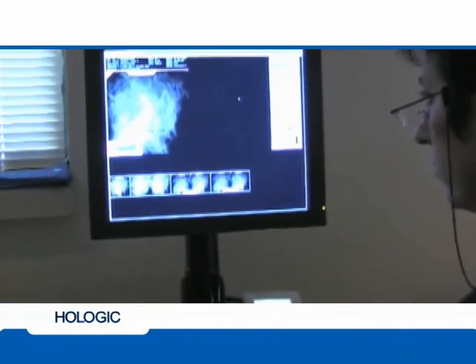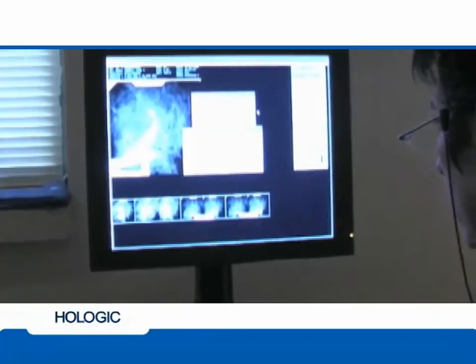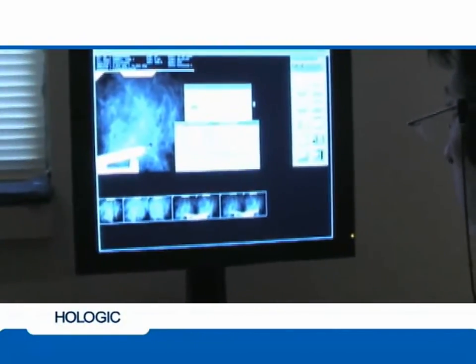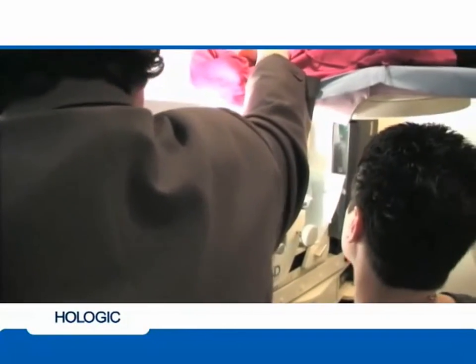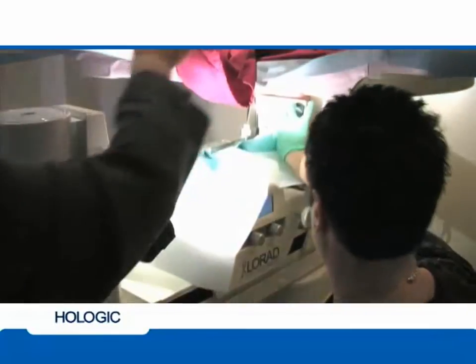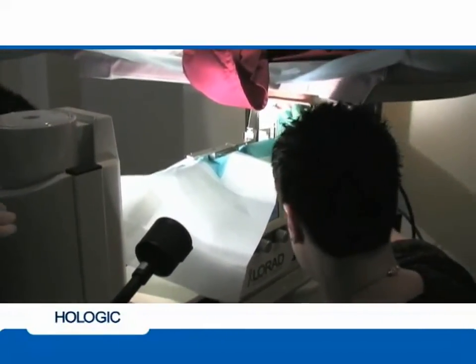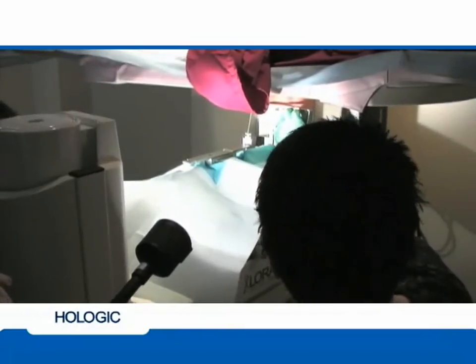A final 0-degree image is recommended to compare your post-procedure outcome to your initial scout image from the beginning of the procedure. After confirmation, remove the introducer marker assembly from the adapter by pinching the tabs to release it from the adapter. Decompress the breast by slowly releasing compression paddles and cradling the breast.